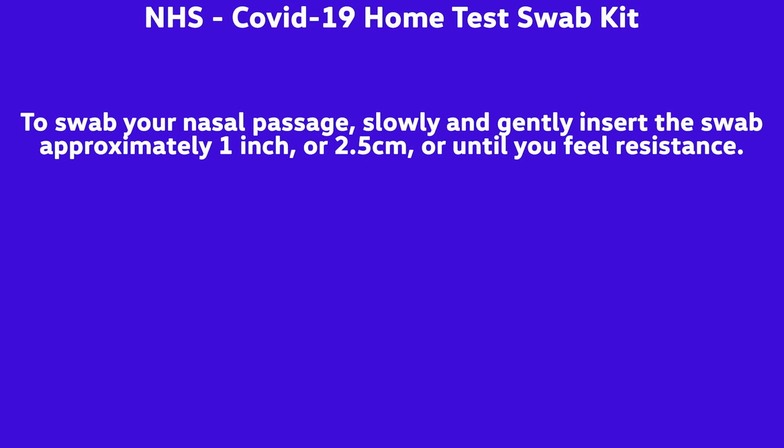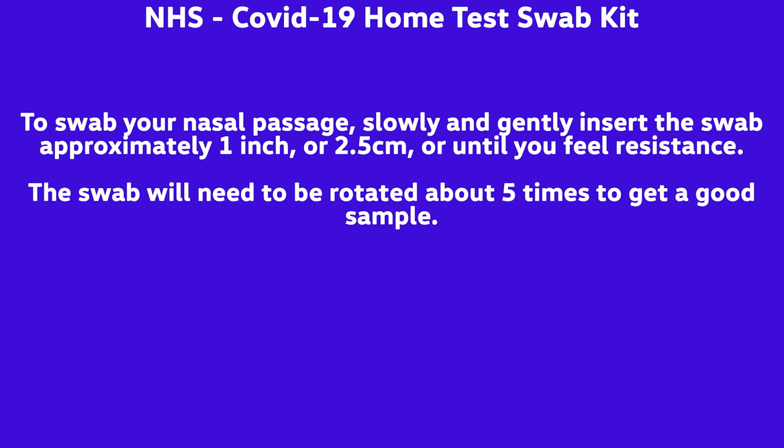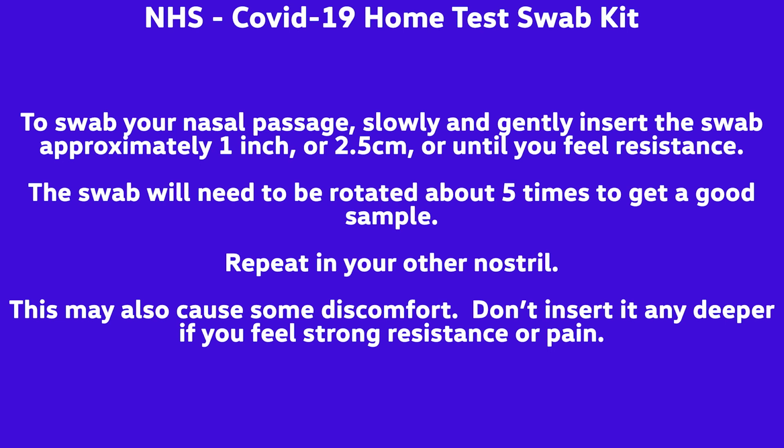To swab your nasal passage, slowly and gently insert the swab approximately 1 inch or 2.5 centimetres or until you feel resistance. The swab will need to be rotated about 5 times to get a good sample. Repeat in your other nostril too. This may also cause some discomfort. Don't insert it any deeper if you feel any strong resistance or pain.